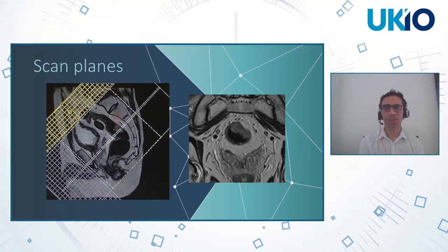High-resolution coverage should be at least 5 centimeters above the top of the tumor, as seen by the upper border of the planning box marked in yellow here. It should also be to the L5-S1 level for all tumors to ensure that discontinuous tumor deposits within the mesorectum are visualized.